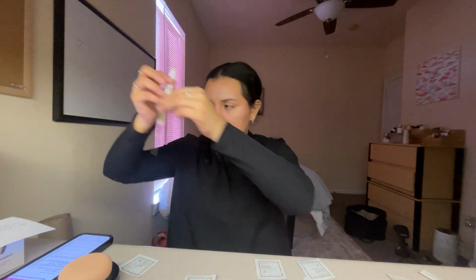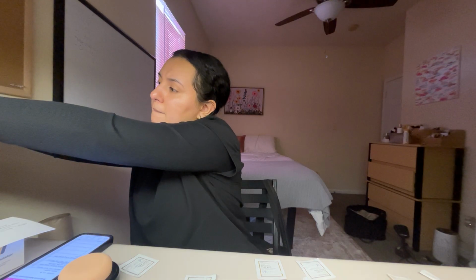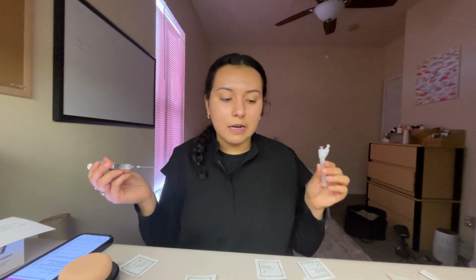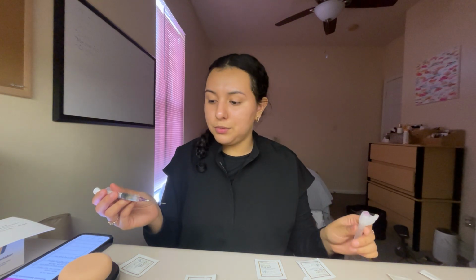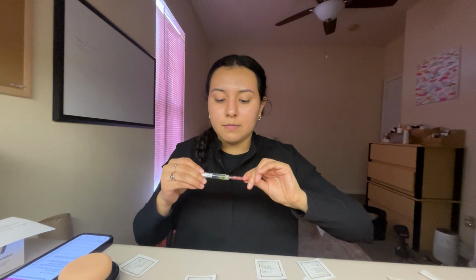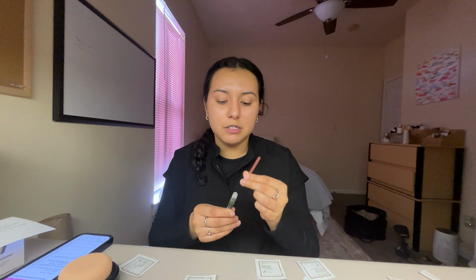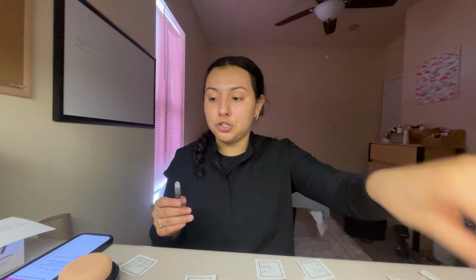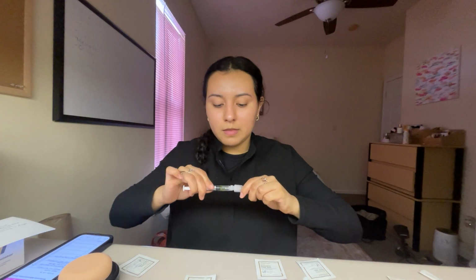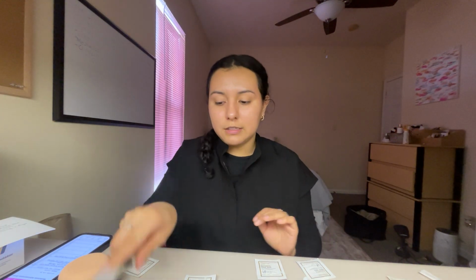Okay, a little bit more. Okay, so I have that. Now we are going to place our cap back on, but we're not going to use the same needle to inject. We're going to change it. So I would dispose of it in the sharps, and then I would grab my new needle and I would connect it, and I would set this aside.